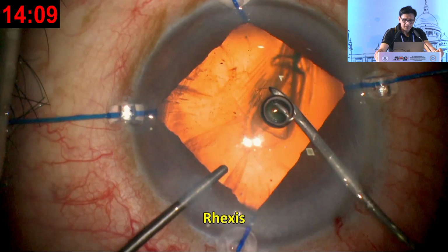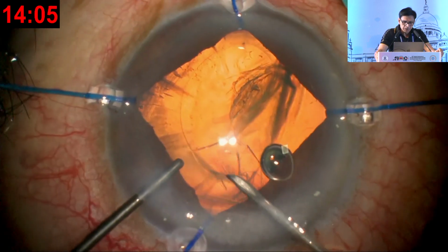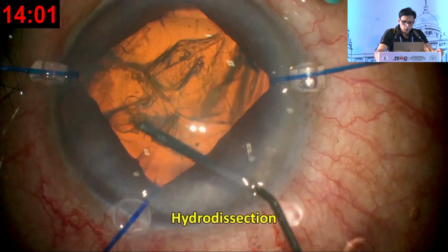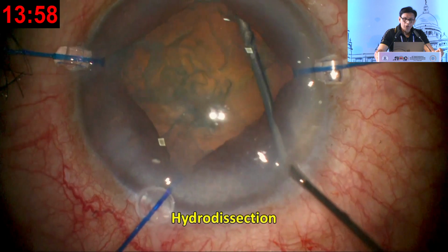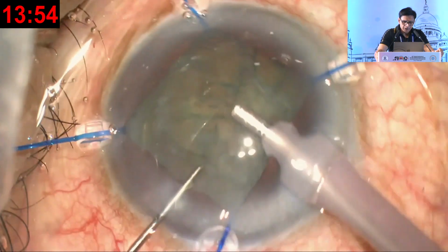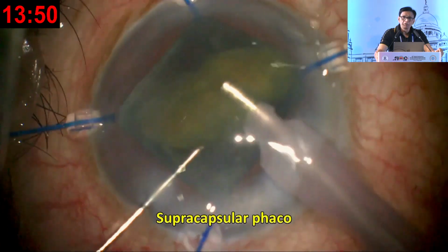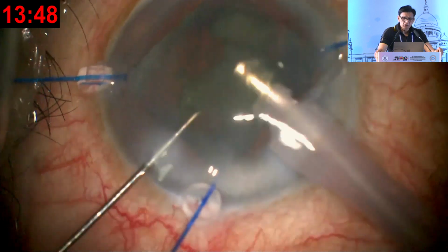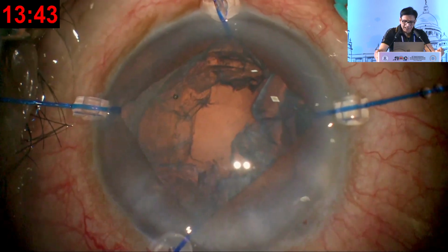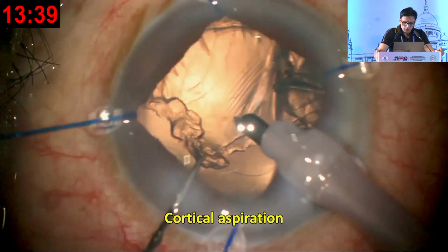Now I am using my iris hooks at this stage. The next step is to do my rhexis. Okay, but I know I am already in trouble. So I am doing my hydrodissection. I am trying to bring that nucleus up anteriorly, and I am doing a supracapsular phaco. At this stage, I am using an air pump to help prevent any endothelial damage. So far so good. I go in for my cortex now, okay?